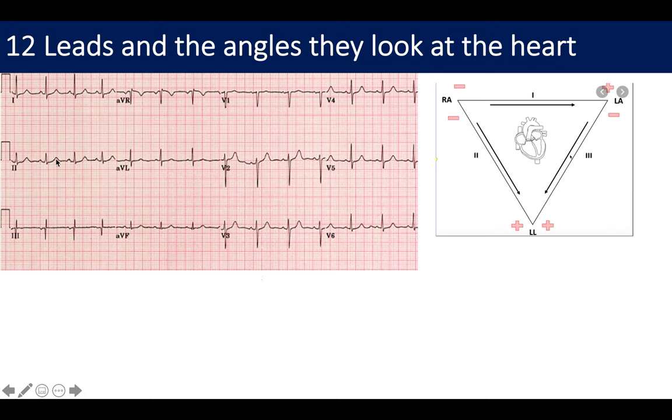As a medical student, doctor, nurse, or cardiologist, you will always come across the leads, from lead 1 to 3 and aVR, aVL, aVF, and V1 to V6. You might be wondering what these leads are.